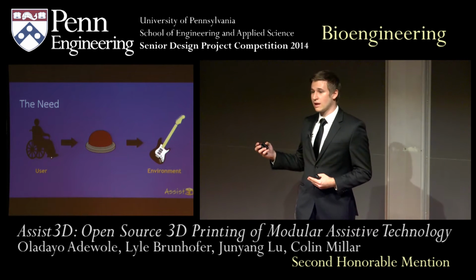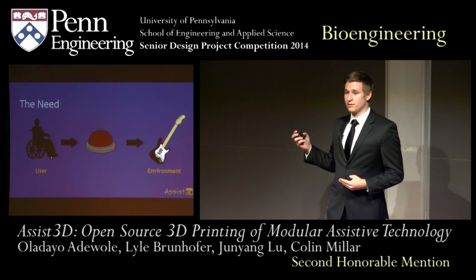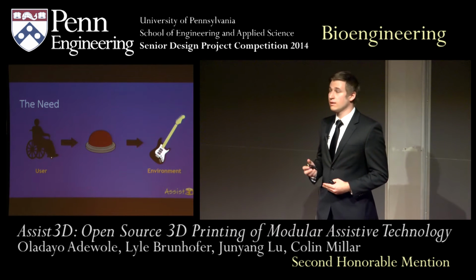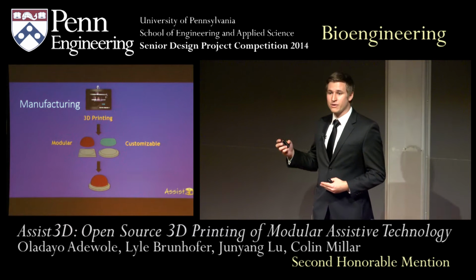On the left, you see our client, and on the right, you see their environment. We have chosen to bridge this gap with our ability switch. But where does it begin? Our process begins with our 3D printer.